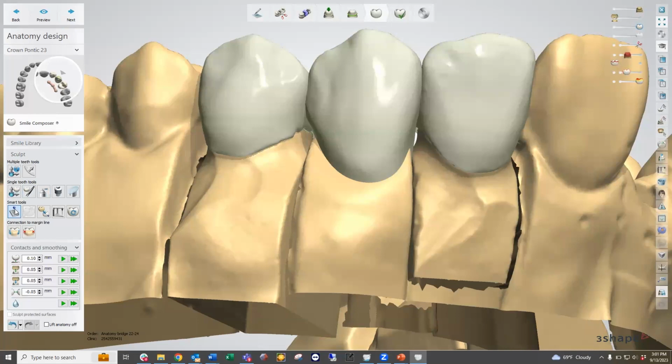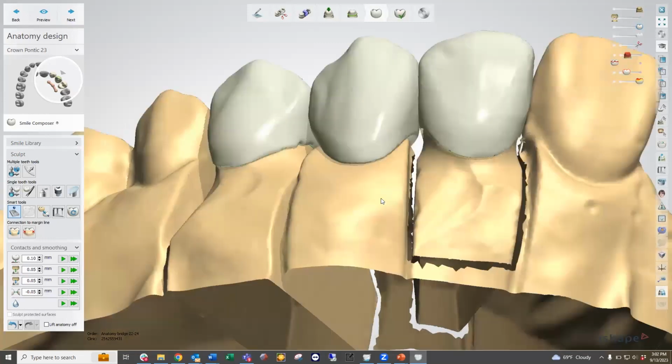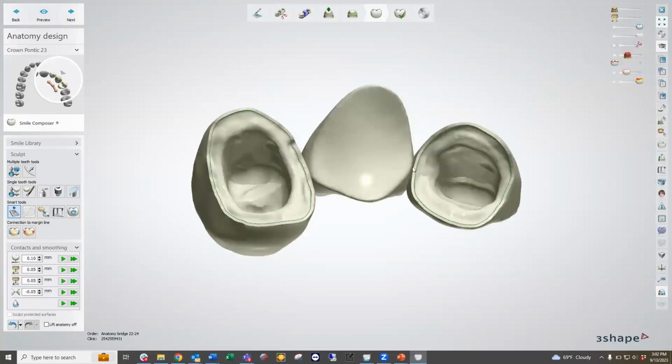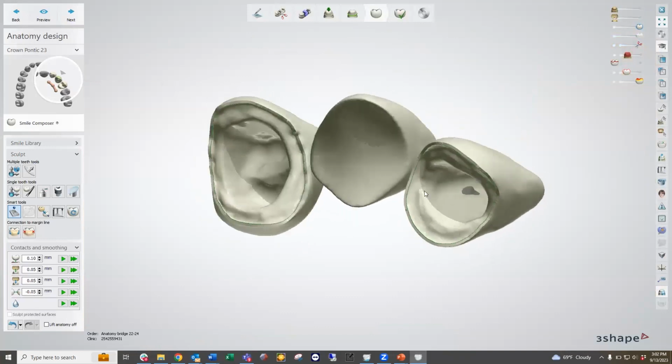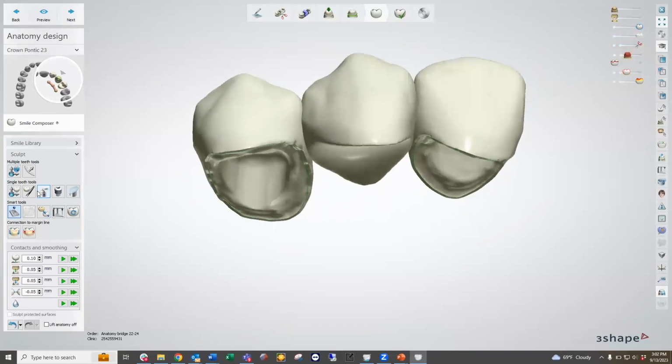Once we select the pontic and go to our smart tools, there's an option that's only relative to pontics, which is the desired distance to the gingiva. This is going to take the unit off the gingiva by this amount. So I'm going to apply that change, and it removes the unit from touching the model as best as it can. What happens when it does that is it doesn't take into consideration any design features of that pontic. It just removes it from its existing relation to the model. So I then take my smooth tool.